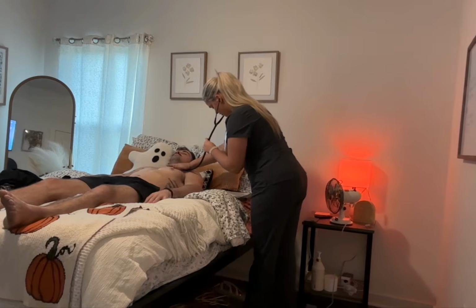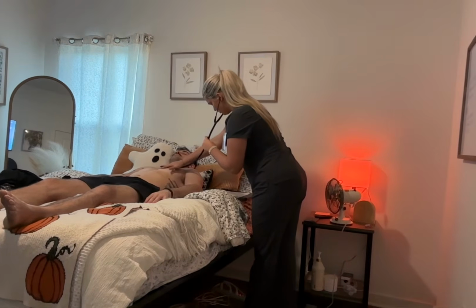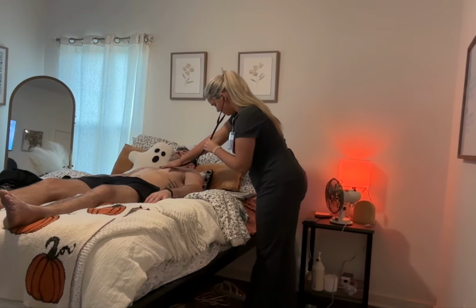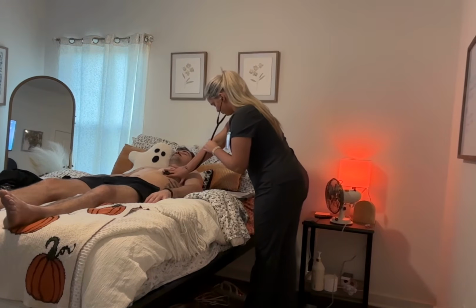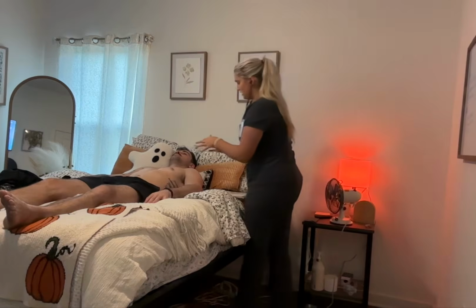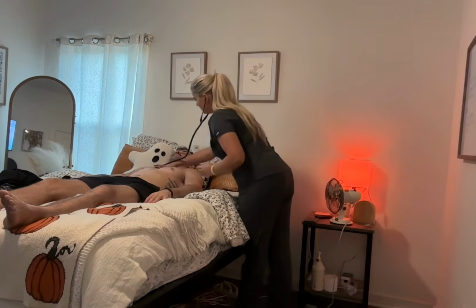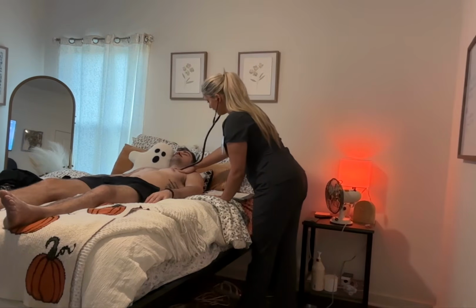Okay, then we're going to go down to the third intercostal space and listen for the Erb's point. Then we're going to go down to the fourth intercostal space, and this is listening to the tricuspid. And then the fifth intercostal space, and this is going to be in the left midclavicular line, and this is the mitral valve. So this is where the apical pulse would be. And we do hear the lub dub. Alright, so I'm going to turn this around to the bell side and listen in the same exact places. So right here I'm listening for a heart murmur and I do not hear one.